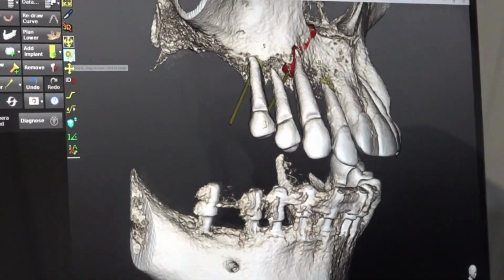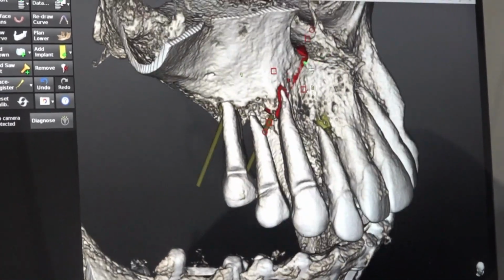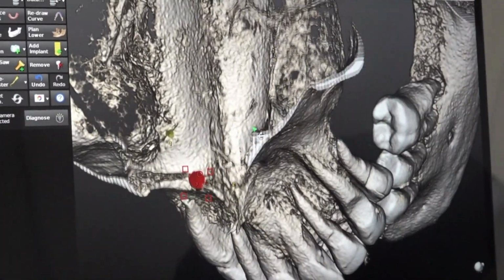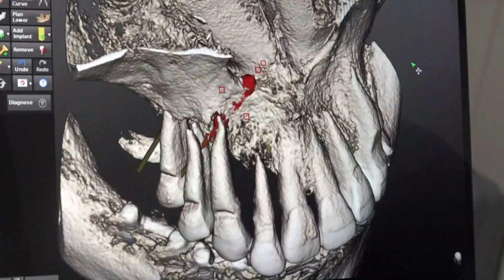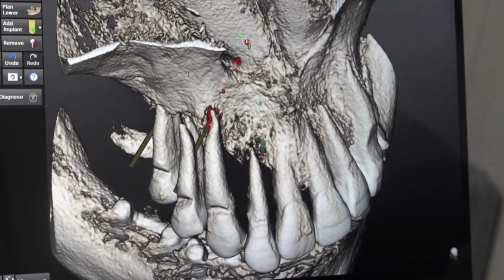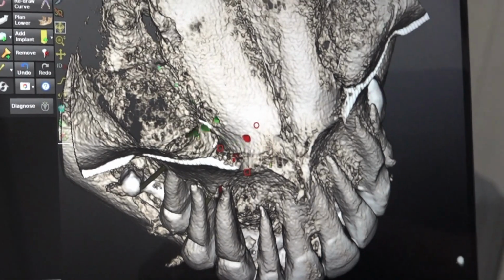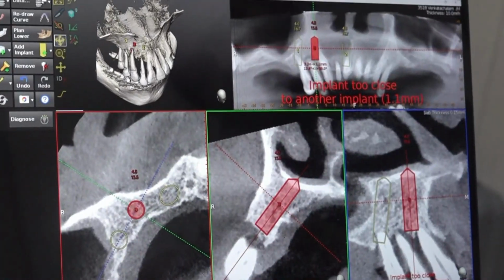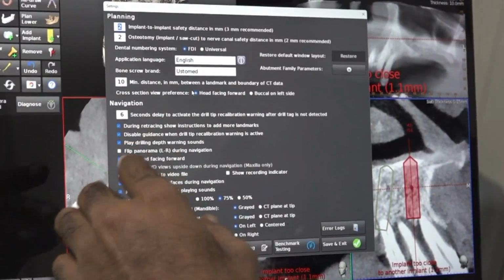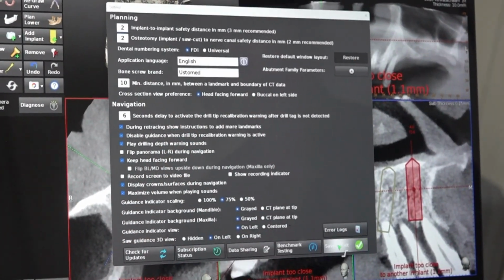We are starting another implant from the second premolar, but it shows close to the adjacent implant. Okay, maybe adjacent to the central incisor. So what we'll do, but now it may be adjacent to this implant. It looks okay, no? Why it is showing that? You see the 2 mm is the implant to implant safety distance.